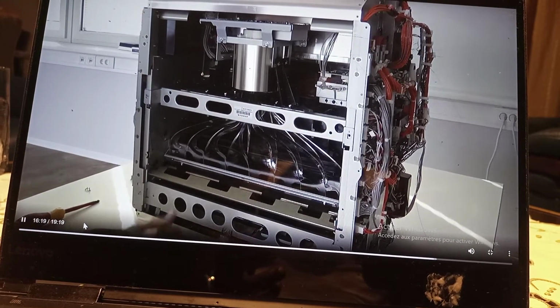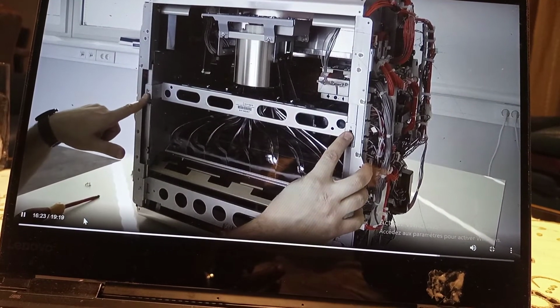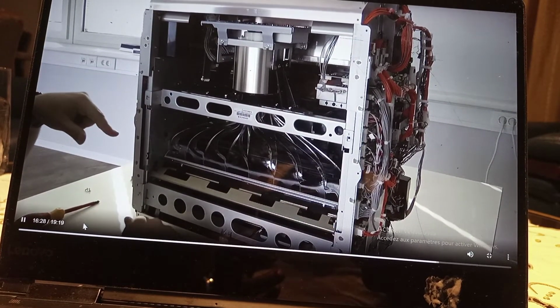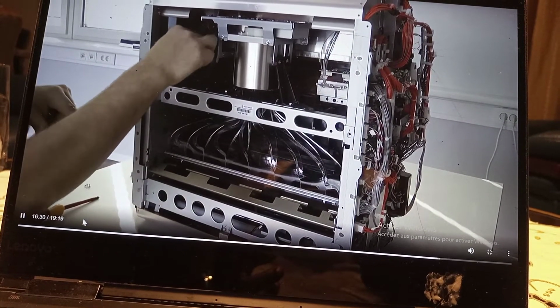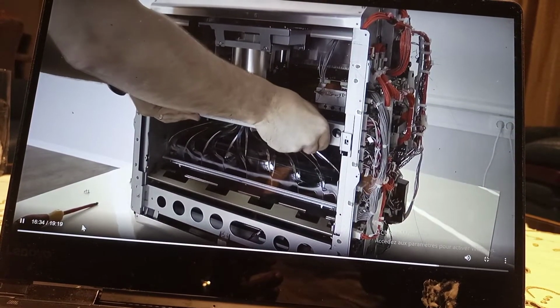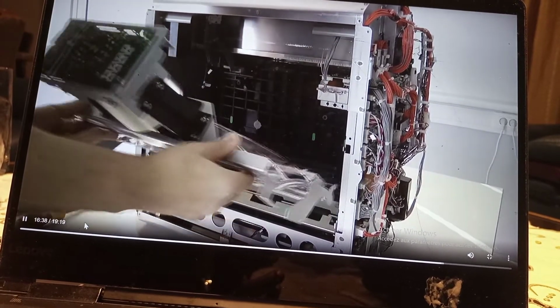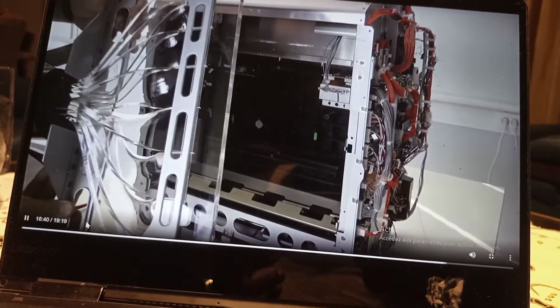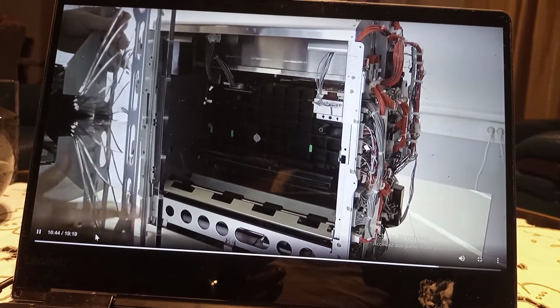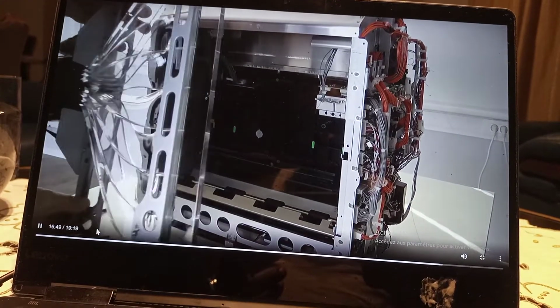Then you have to loosen 6 screws, 2 of them here, 2 of them on each side here on the lower part. And after that, you can take the complete unit out. Be careful, don't touch this surface here in the front area, don't touch this.